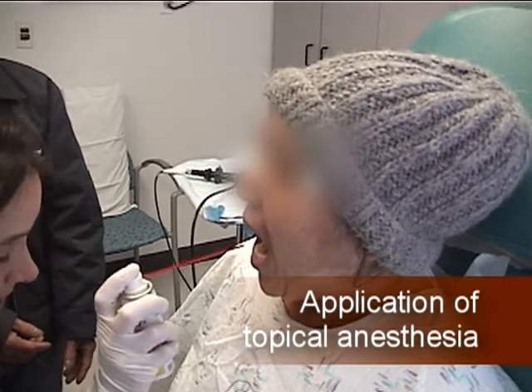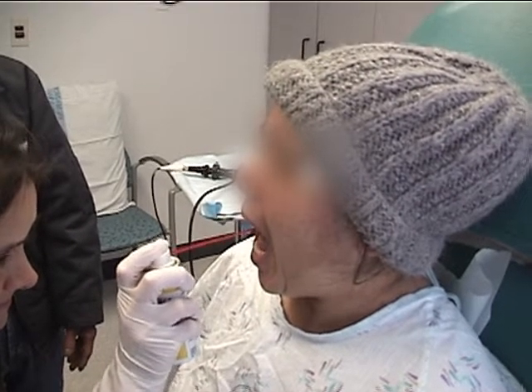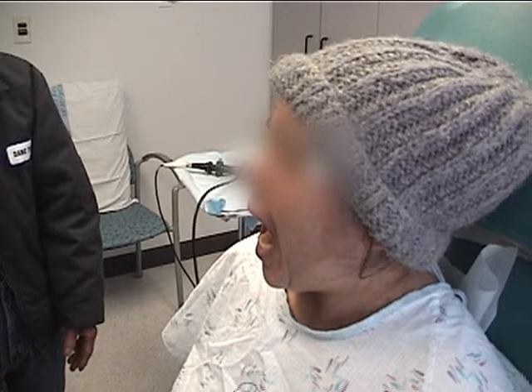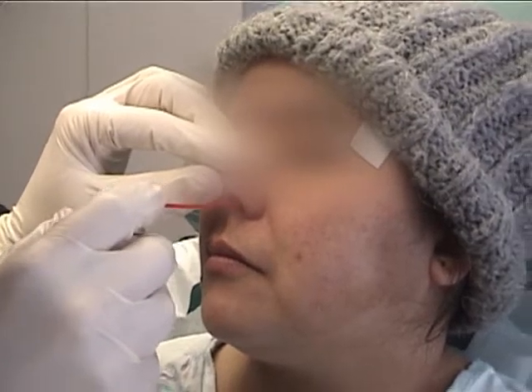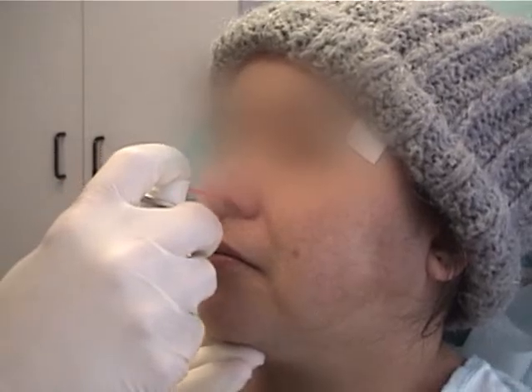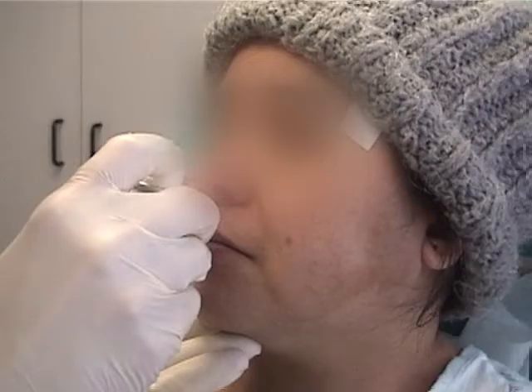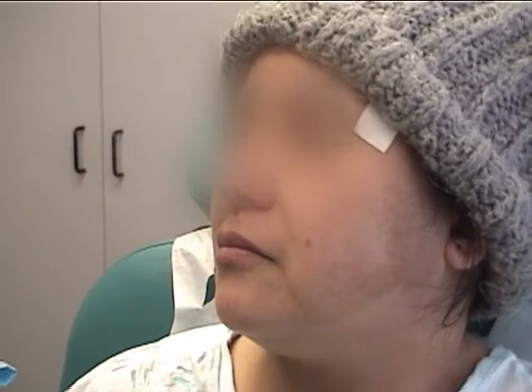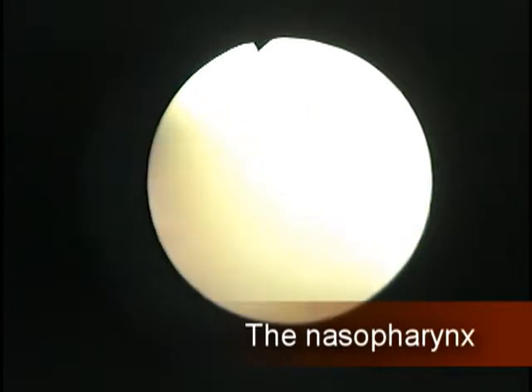To prepare for the scope insertion, spray the nares with a decongestant solution. Then anesthetize the throat with a topical anesthetic, followed by application of the anesthetic into the selected side of the nose for scope passage. First, spray the anterior aspect of the nares, then insert the spray tip perpendicular to the plane of the face along the floor of the nose. As the patient holds their breath, apply the anesthetic to the deep aspect of the nose as the tip is withdrawn. Carefully advance the nasopharyngoscope along the floor of the nasal passage below the inferior turbinate.